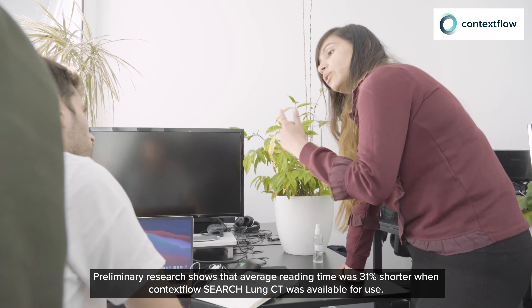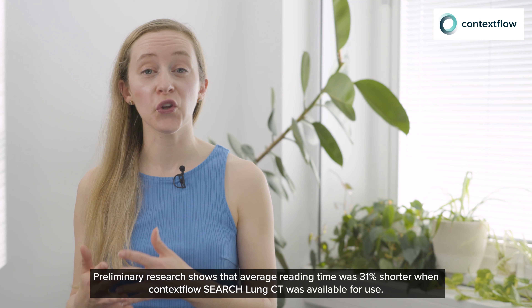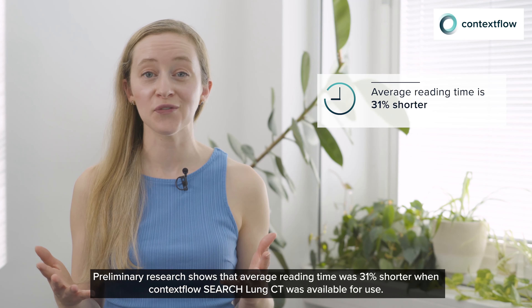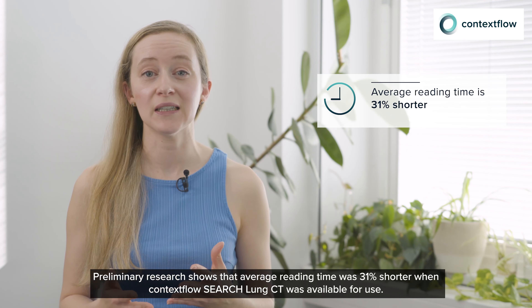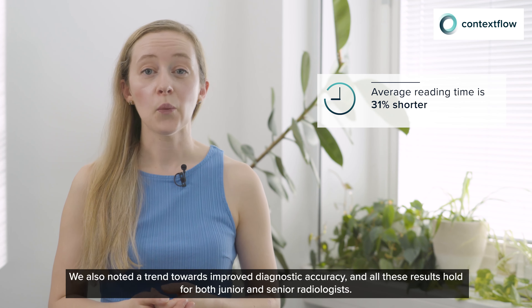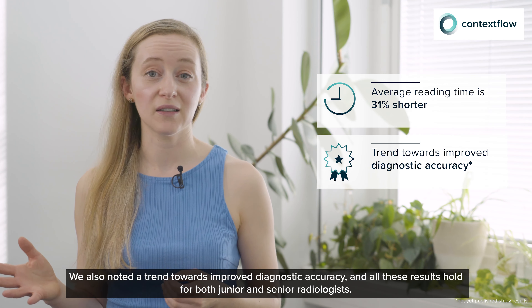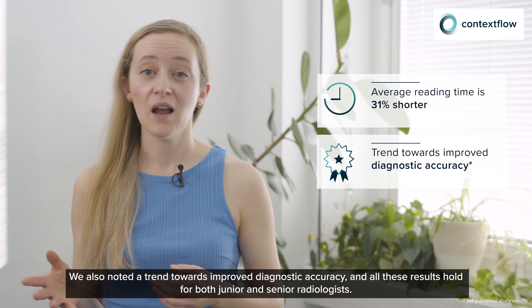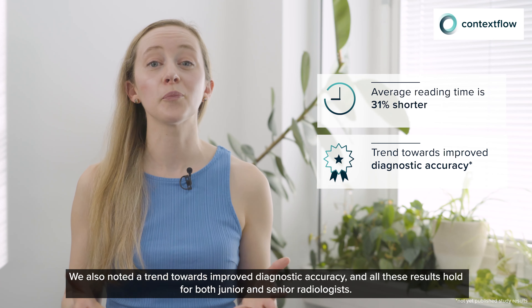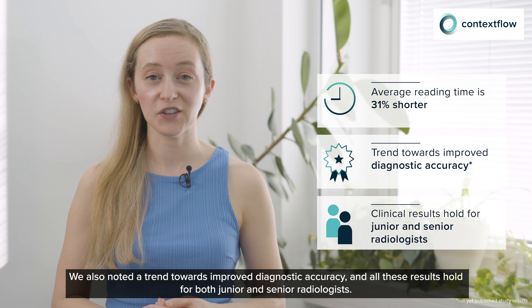Preliminary research showed that average reading time was 31% shorter when Contextflow Search Lung CT was available for use. We also noted a trend towards improved diagnostic accuracy, and all these results hold for both junior and senior radiologists.